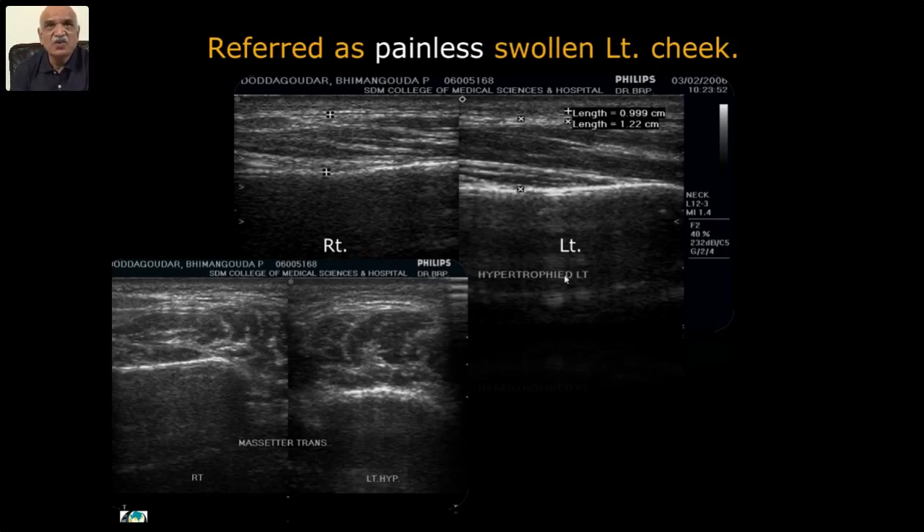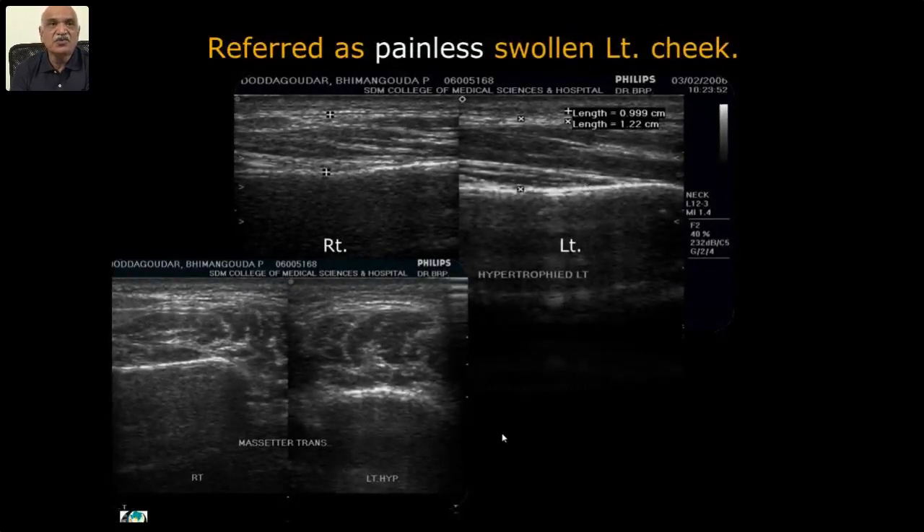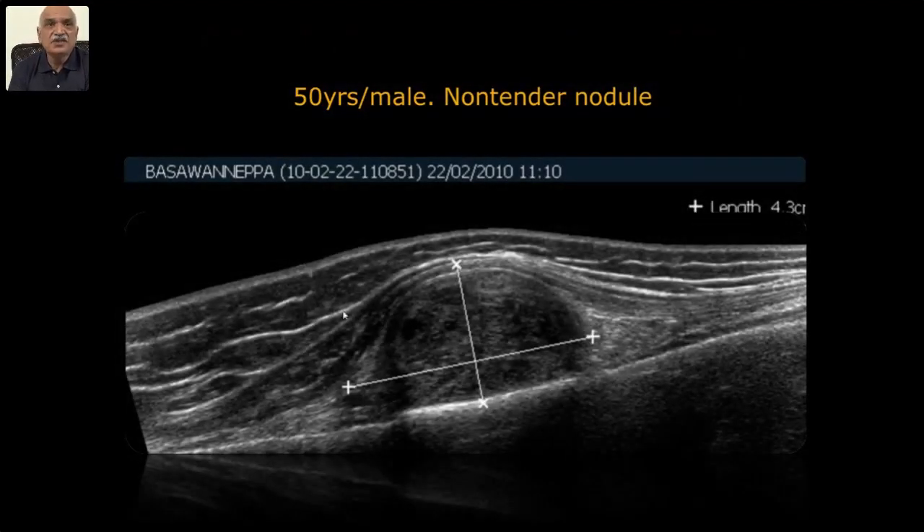Selective cases are referred — benign hypertrophy of the masseter is one of the differential diagnoses for painless swollen cheek on the left side. A non-tender nodule: with beautiful layers you can see the masseter — we could describe it as a benign connective tissue tumor intra-masseteric, and it came out as a neurofibroma. The point is: the beautiful anatomy, its location, its relation to the masseter (intra versus extra), and possible benignity or otherwise.